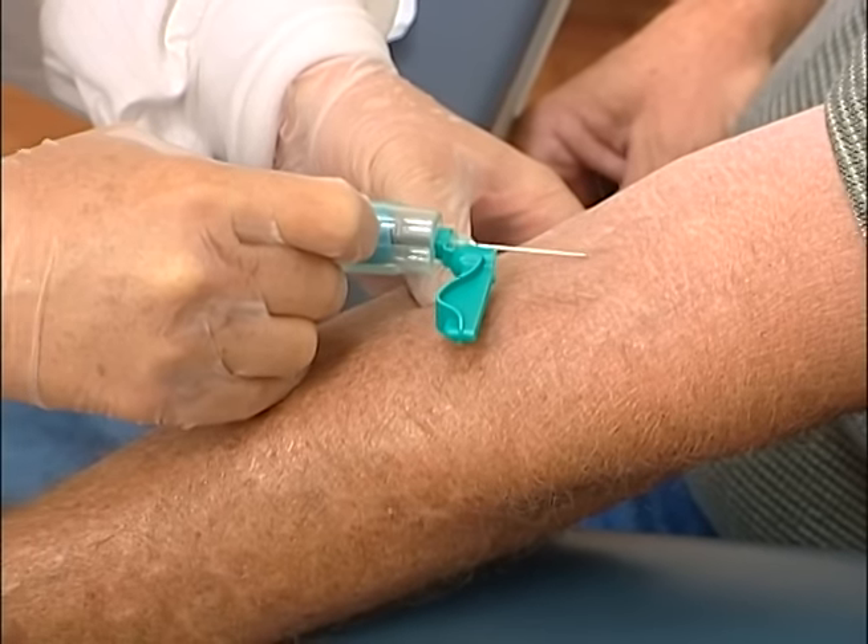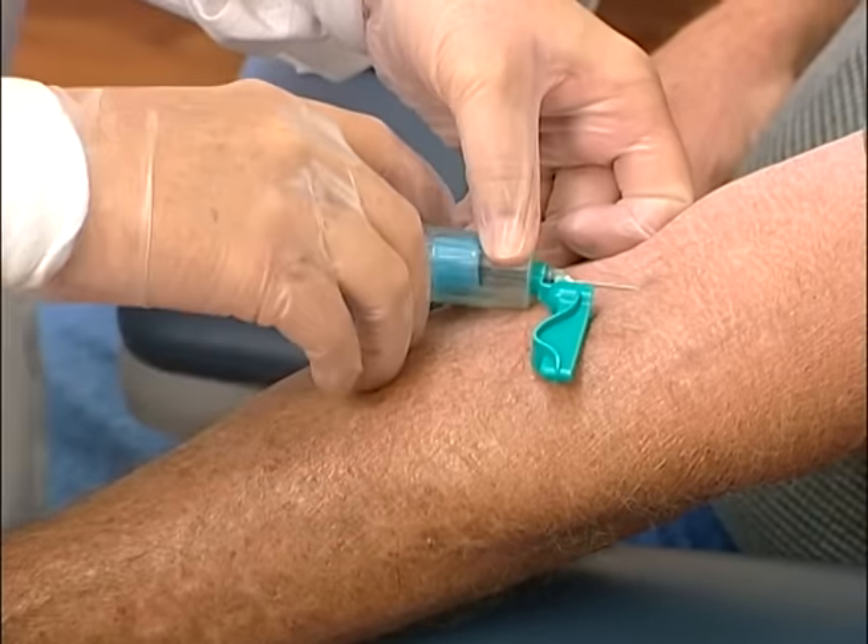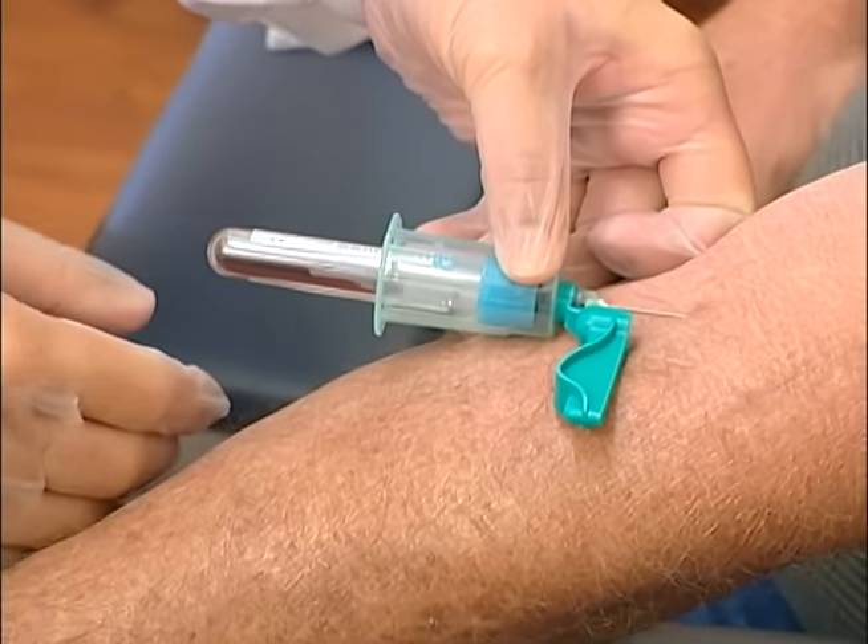Insert the needle with the bevel up at a 30 degree angle or less until you perceive yourself to be in the center of the vein.